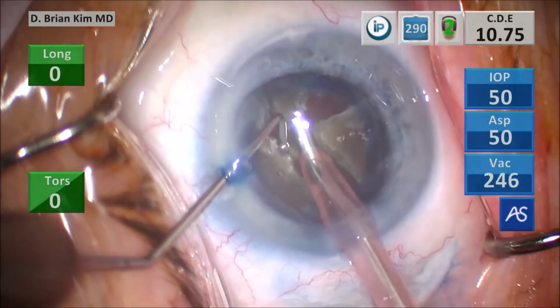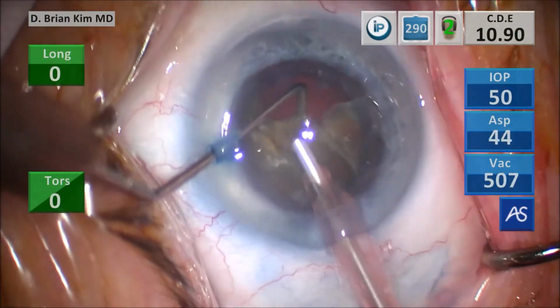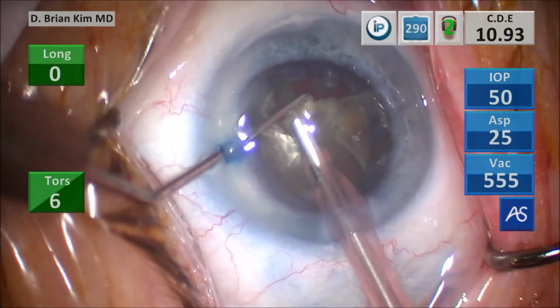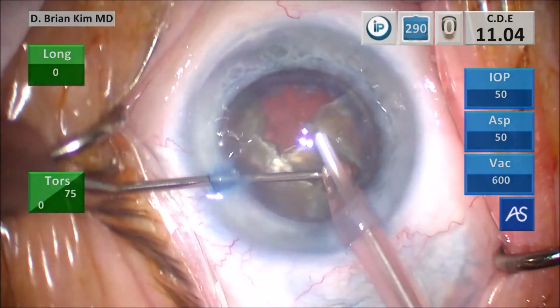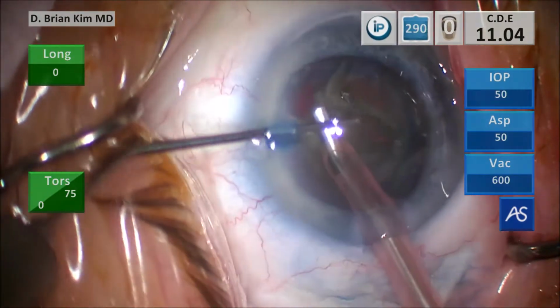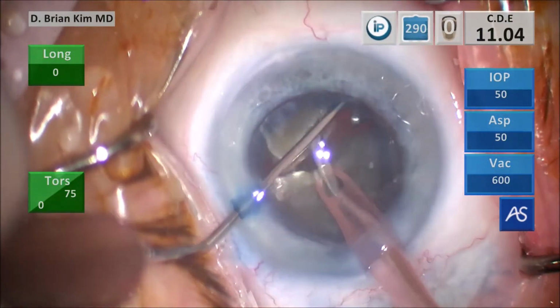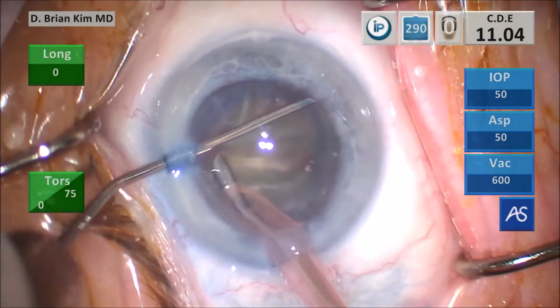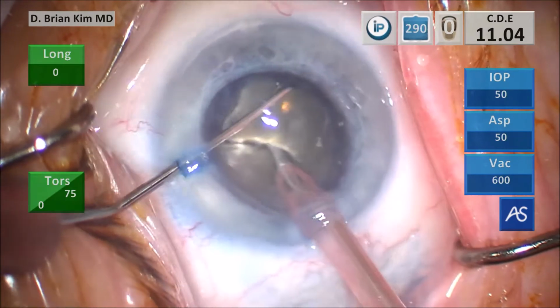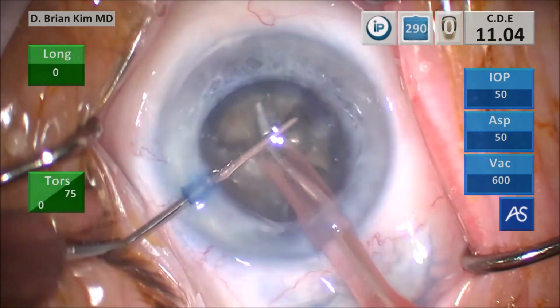Again, grabbing that other piece up, hooking the lens, and crushing the lens between the instruments completely, and then emulsifying the lens piece. You can see, even though I did a complete chop, it's still jigsawed together. Go ahead and separate that second quadrant from the rest of the lens. Again, sliding under the lens, hooking the peripheral lens, crushing it against the phaco tip with another cross chop maneuver.